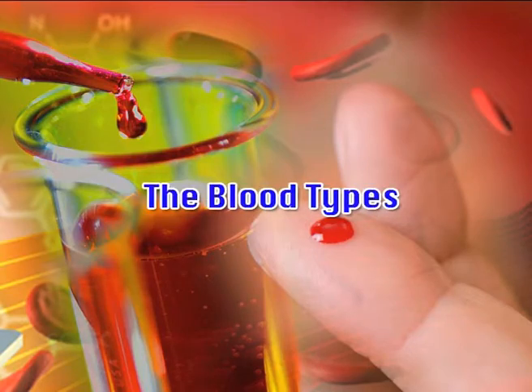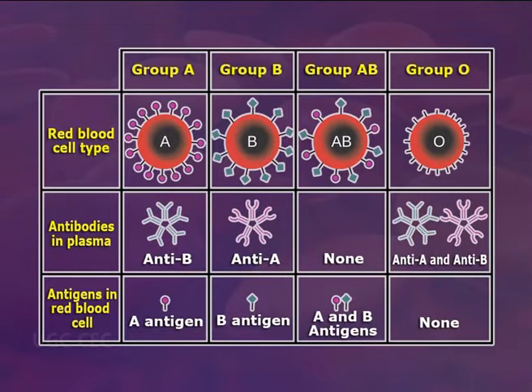The blood types. The ABO blood typing system groups the individual blood into one of the four categories. Blood group AB individuals have both A and B antigens on the surface of their RBCs and their blood plasma does not contain any antibodies against either A or B antigen.